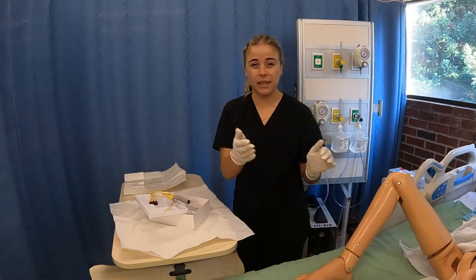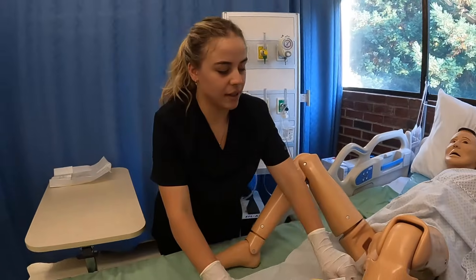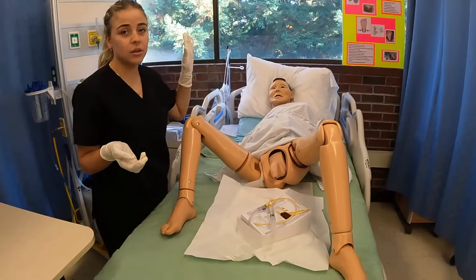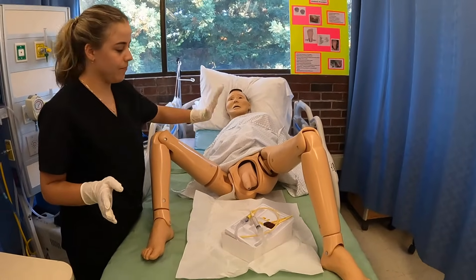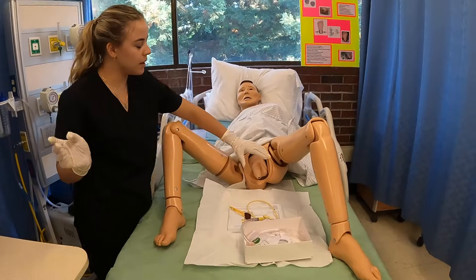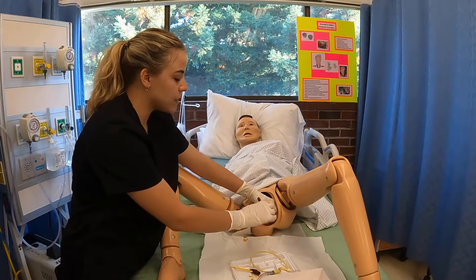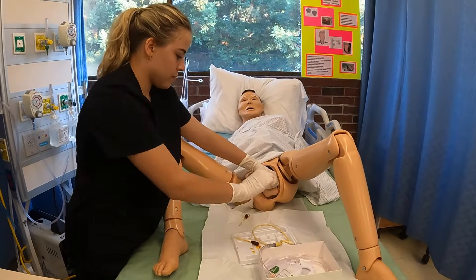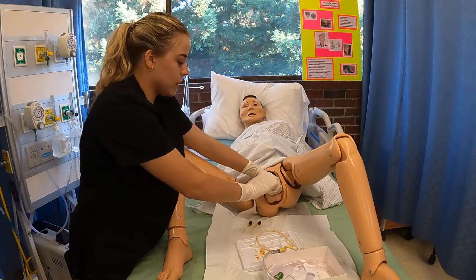Another personal preference — I like to put my whole kit onto the patient's bed so it's easier for me to move around. We're going to set the tray down on the patient's bed. Now with your least dominant hand, that's where you want to grab the genital area, and once I place my hand on that area, I cannot move it. I'm going to get my iodine to cleanse the area. We're going to go towards the middle and out, and I like to drop it once I'm done so I'm not going over my sterile field. One more time, drop. One last time, drop.